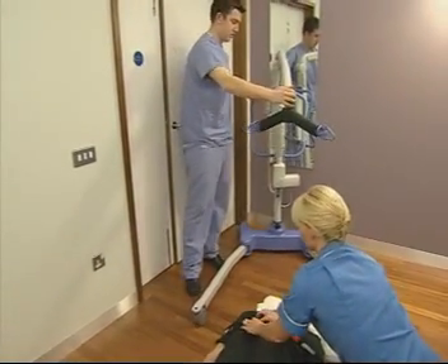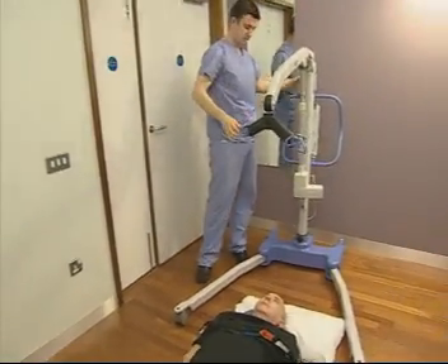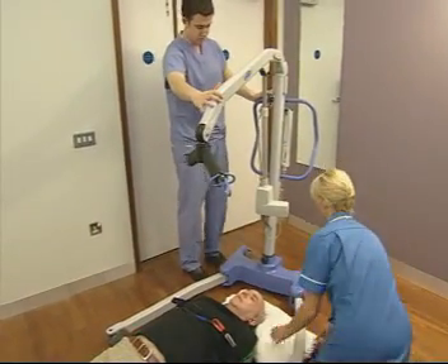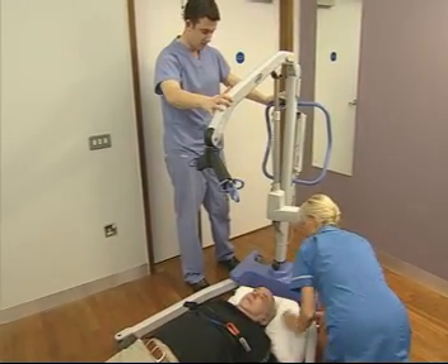Placing the straps across the patient's chest will prevent the wheels of the lift running over them as it's brought in. Bring the lift in at a slight angle to the patient and as close to their head as possible, bringing the pillow up behind their head if necessary.